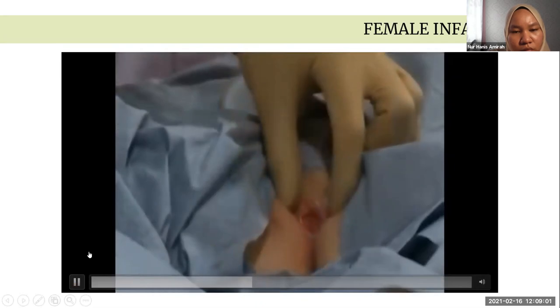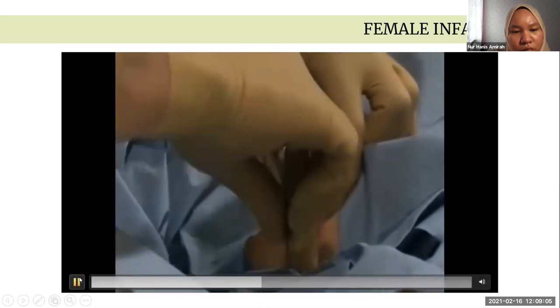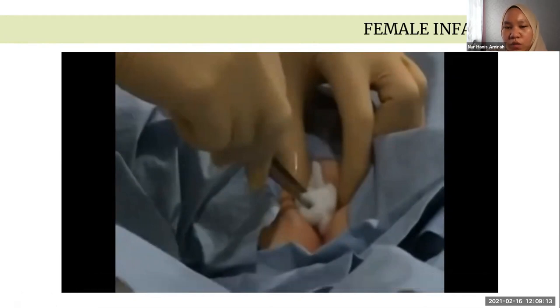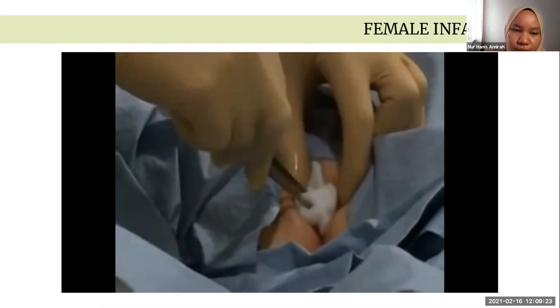With your thumb and index finger of your non-dominant hand, separate the labia, which are considered to be non-sterile. With your dominant hand, use antiseptic-soaked sterile swabs or povidone iodine swab sticks to wash the urethral meatus 3 times. During cleansing in between the labia minora using the antiseptic, you need to do it from anterior to posterior so that it will not introduce fecal material towards the field.